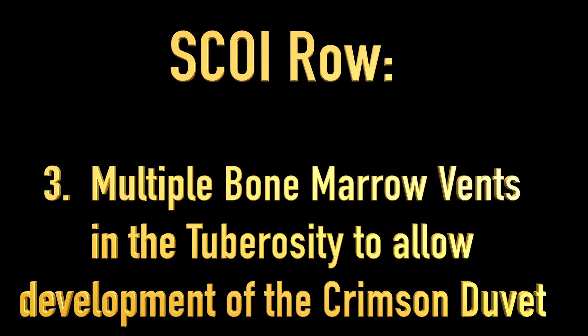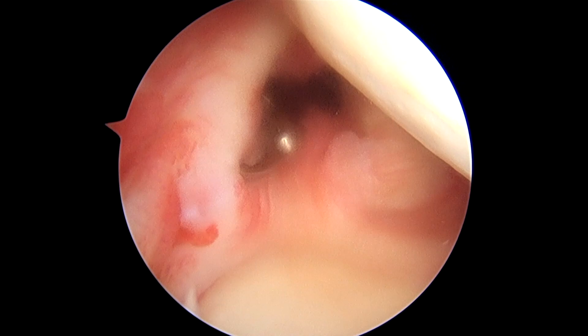Multiple bone marrow vents are created in the tuberosity to allow development of a crimson duvet. We'll begin the diagnostic arthroscopy while viewing from the posterior portal.